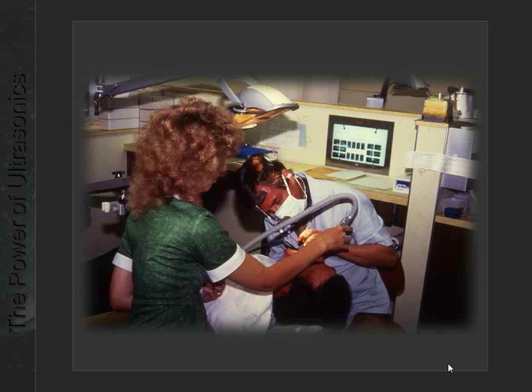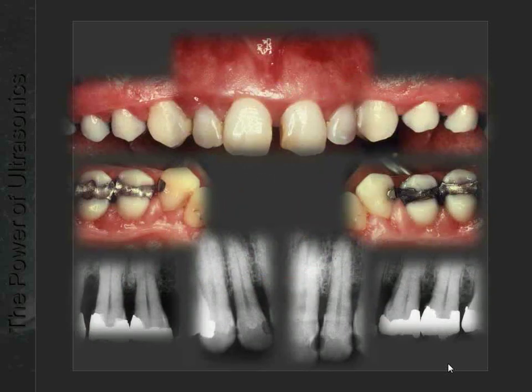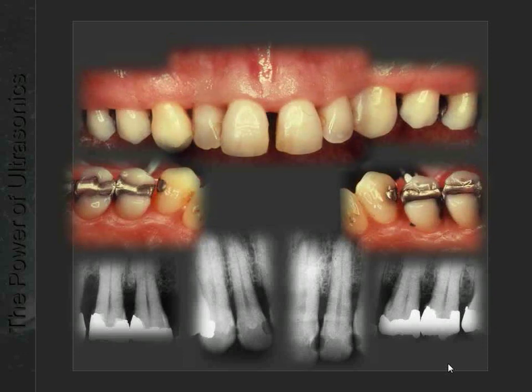But maybe it's good to understand what type of patients they treated. So as a hygienist, you probably want to start to get to work immediately. Look at the nice inflammation that you got here. Look at the advanced bone loss that was present at these teeth. And if you compare to what they did here, I think you can say this was a successful treatment.